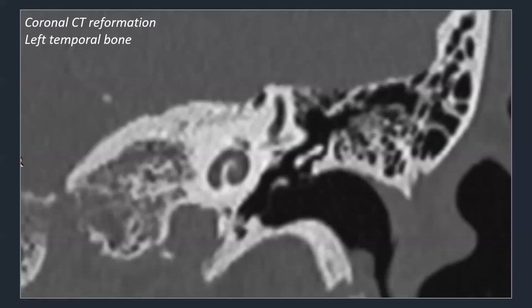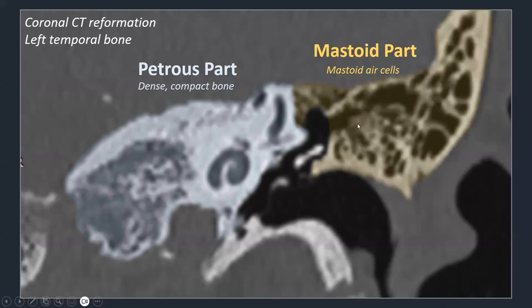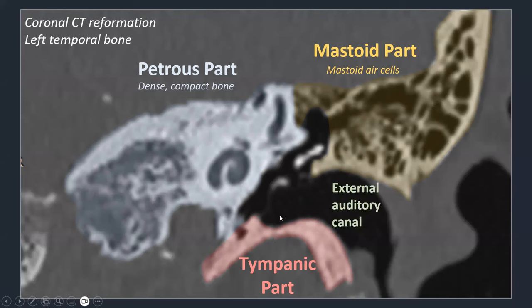On coronal reconstructions of the left temporal bone, we see the cochlea, part of the semicircular canals, the very dense compact petrous bone, and the mastoid part with many air cells. We can identify two cavities: the external auditory canal with the soft tissues of the auricle, and the tympanic cavity, which contains the ossicles — the very small bones responsible for transmitting sound from the eardrum to the neurovascular structures of the cochlea.